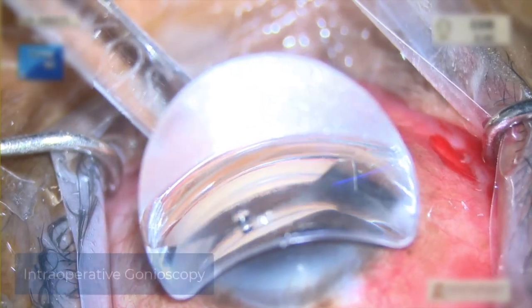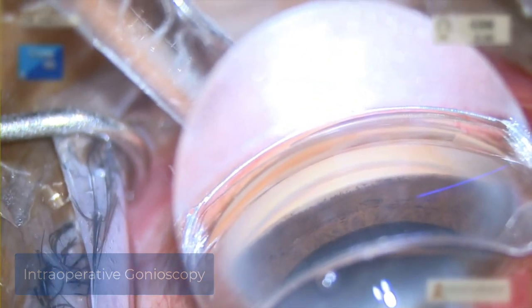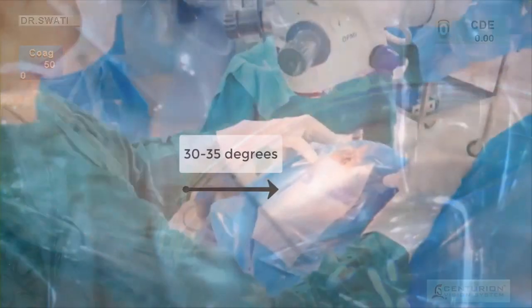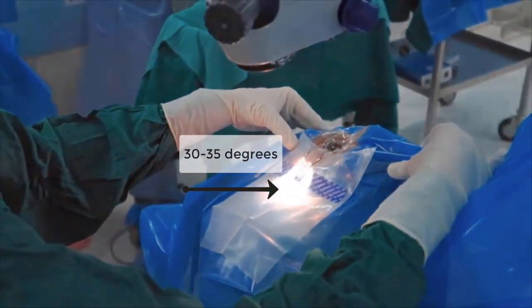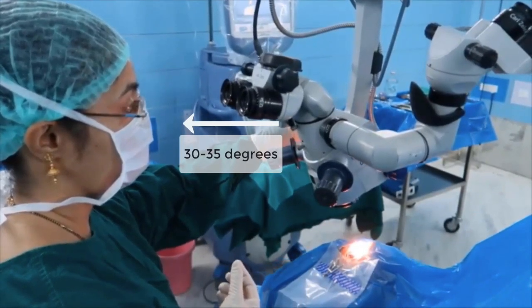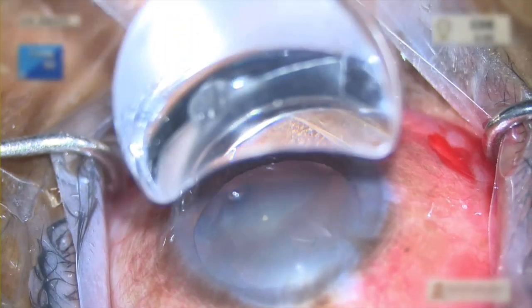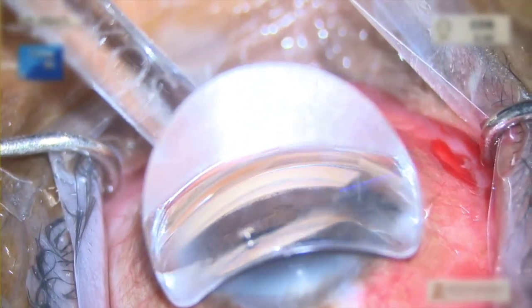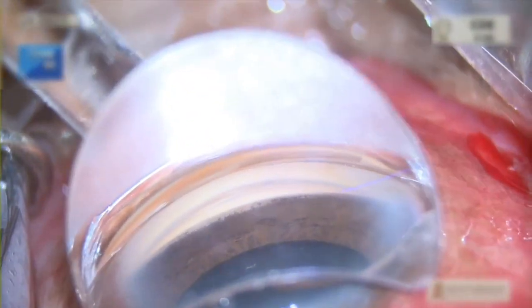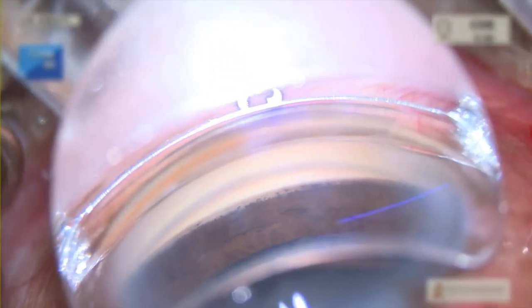Initial intraoperative gonioscopy can be practiced on routine cataract cases before initiating or after completing the surgery. Tilt the patient's head 30 to 35 degrees away from you and tilt the microscope 30 to 35 degrees towards you. Put a drop of OVD on top of the cornea and gently place the Swan-Jacob gonio lens over this drop. Adjust the microscope magnification, start from a lower magnification, and then slowly increase it using the microscope foot switch till you get a clear view of the angle structures.